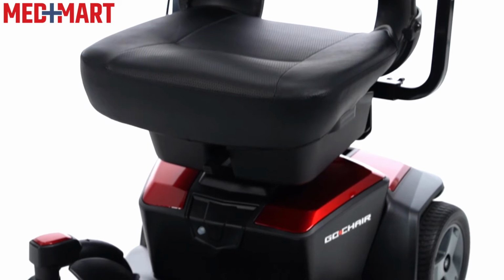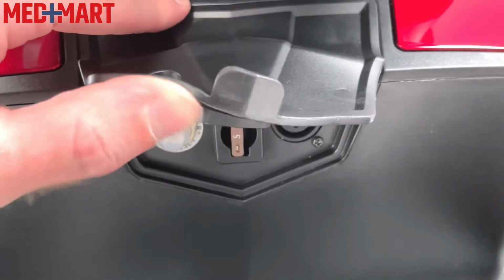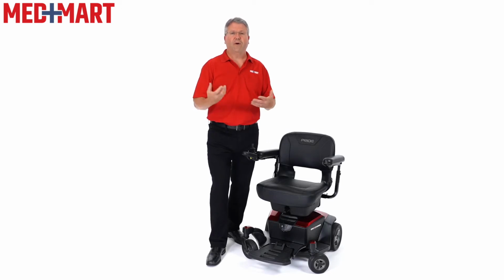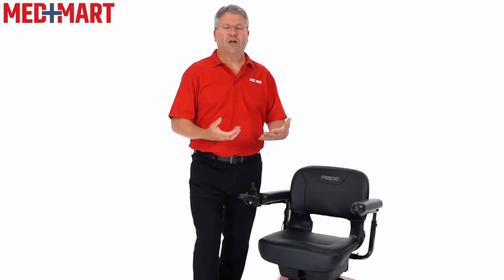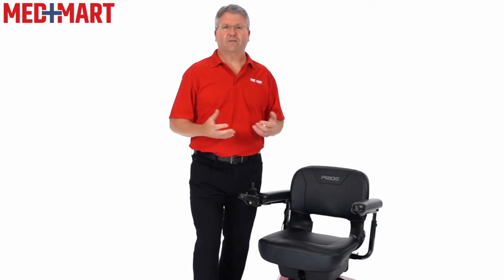The batteries themselves can be charged either at the battery pack or up here on the front of the joystick. This is nice because I don't have to bend over. The other spot for charging is right on the front of the battery pack. So if I'm traveling with it and I just want to bring the batteries inside, charge them that way, I can. Also, if it's wintertime and I don't want to leave the battery sitting in the garage, I can bring the battery pack inside and keep them charged on a weekly basis, because what I always like to tell my customers is batteries like to be charged.